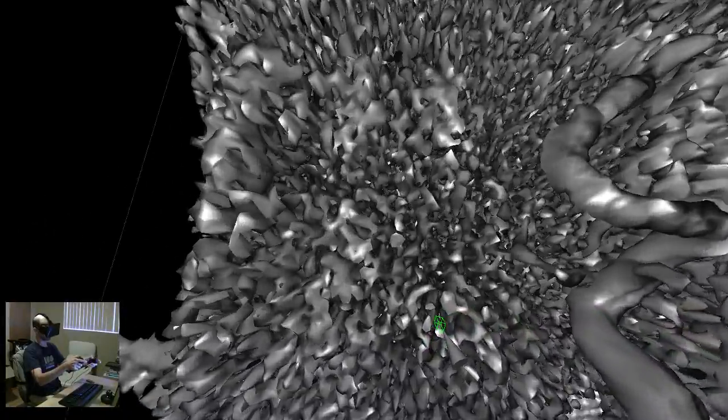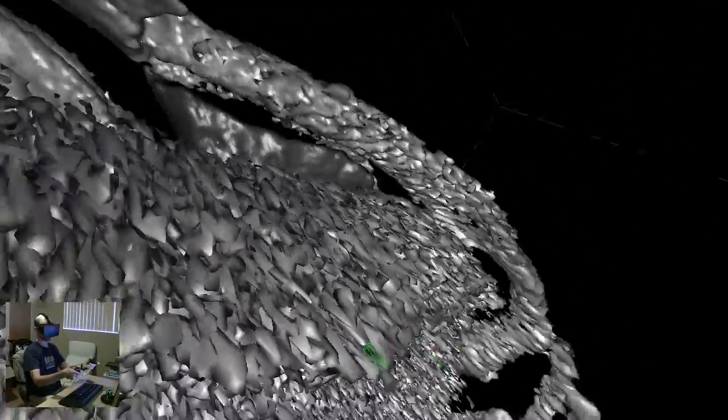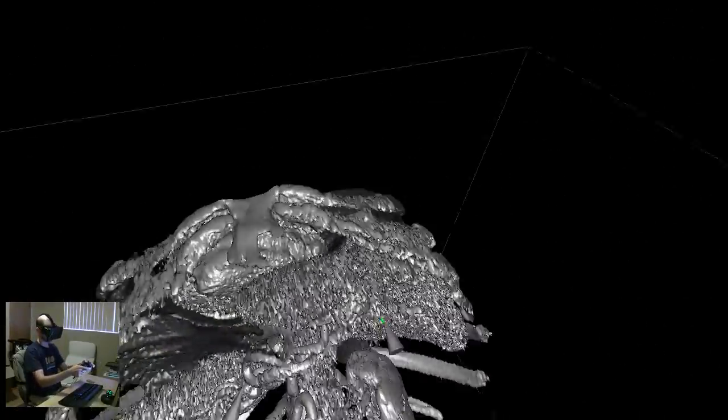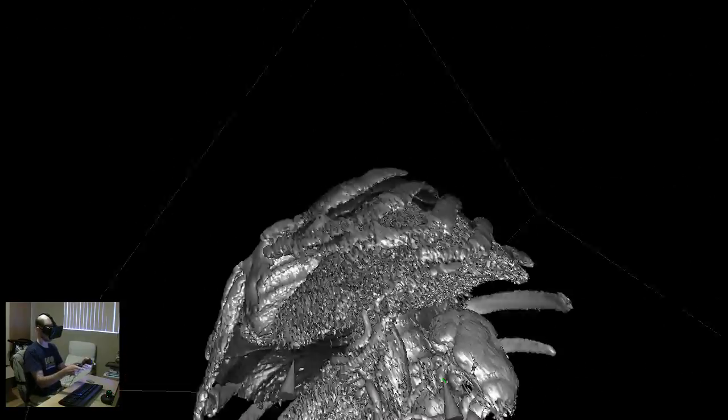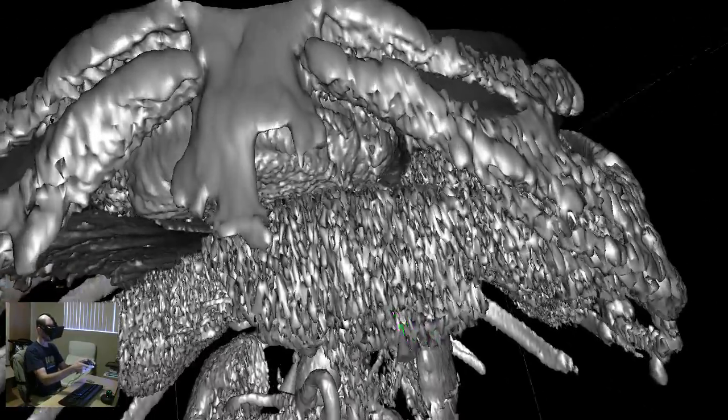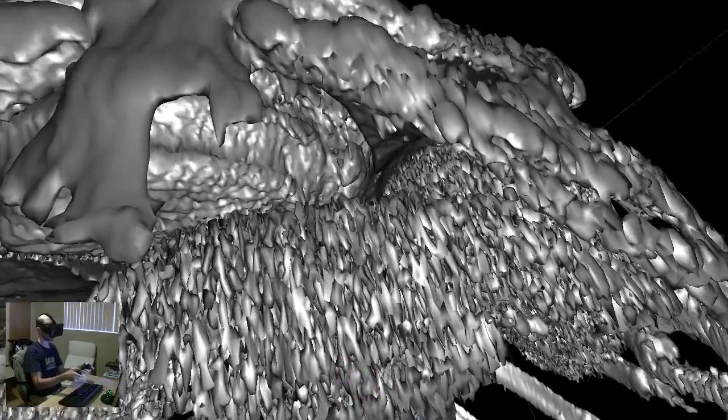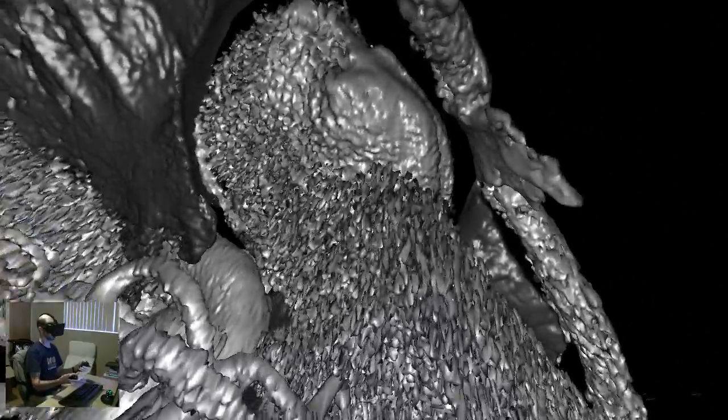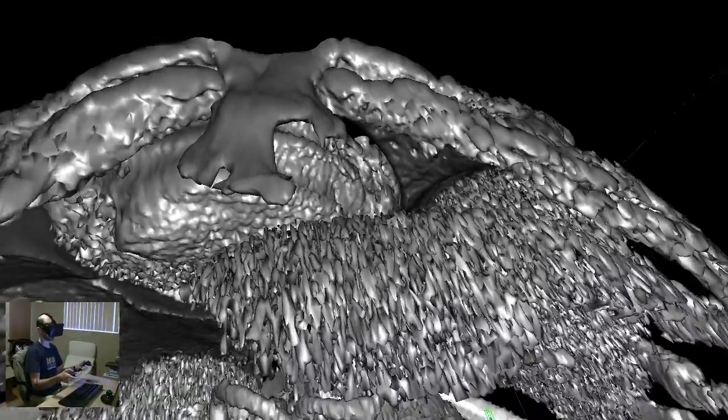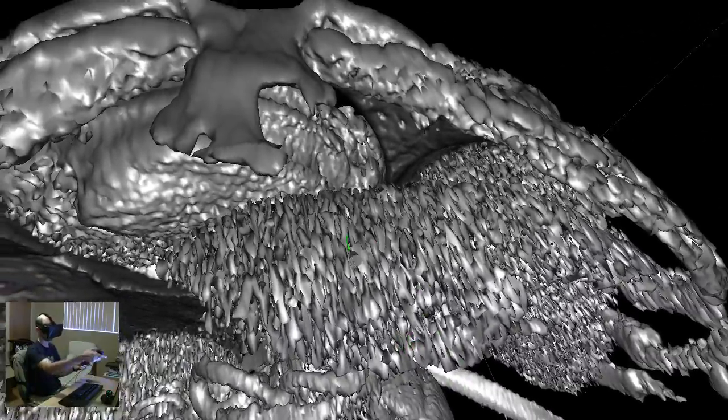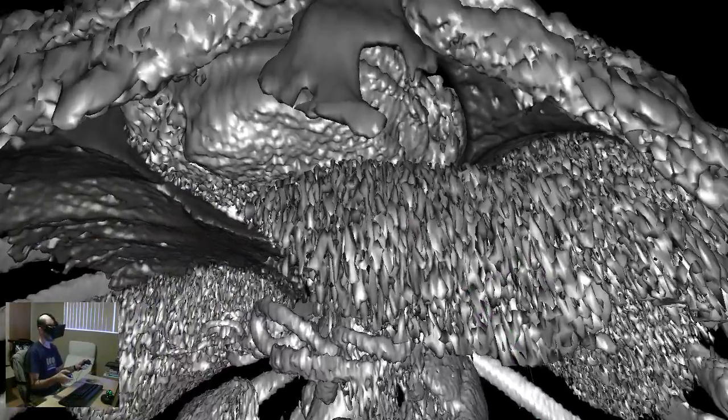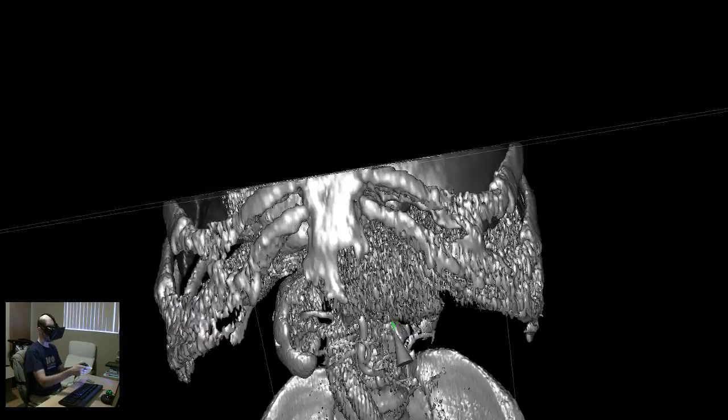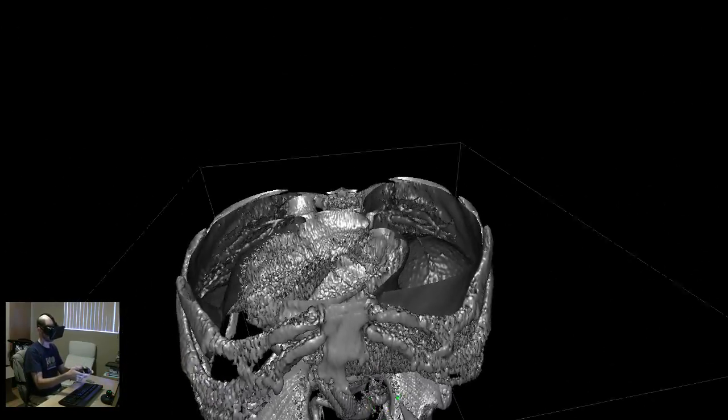This stuff that you're seeing here, that kind of fractal looking stuff, that is a typical side effect of using isosurfaces on CAT scan data. Isosurfaces are a differential operator. They are a high pass filter, so to speak. And so if the data are noisy, then getting an isosurface from a noisy part of the data will just give you a space-filling curve like this one. They do work really well, but there is this caveat.